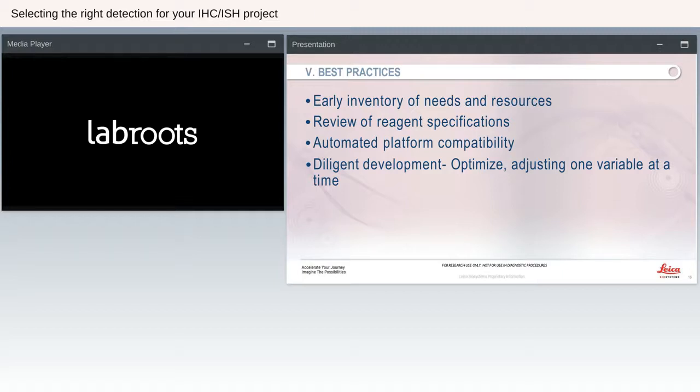Specifically, an example of that would be chromogen substrates. Some of the substrates are not solvent stable or solvent proof. They will dissolve in different organic solvents, so you can't run them down the way you normally would just a DAB stain or something like that. You may get some products in the end with absolutely no staining on them because it dissolved into your mounting media. Automated platform compatibility. There are lots of automated platforms out there right now.